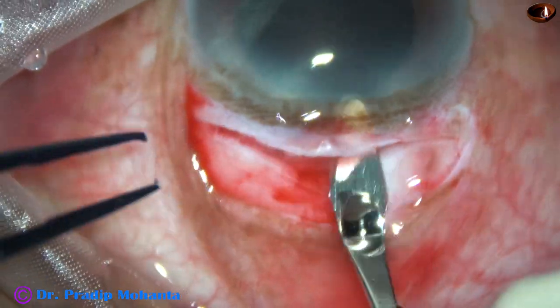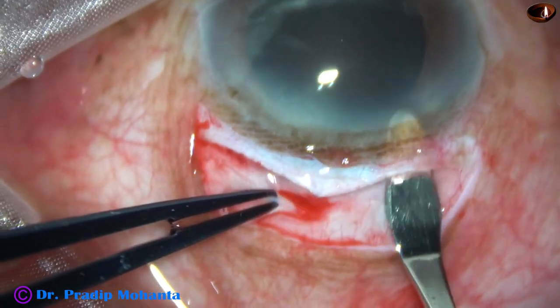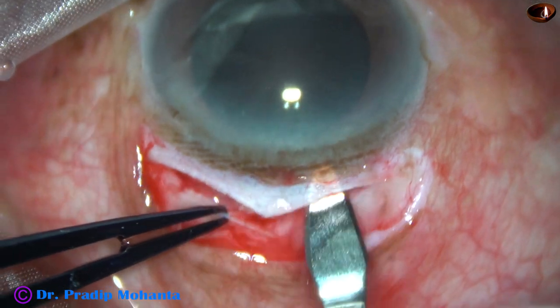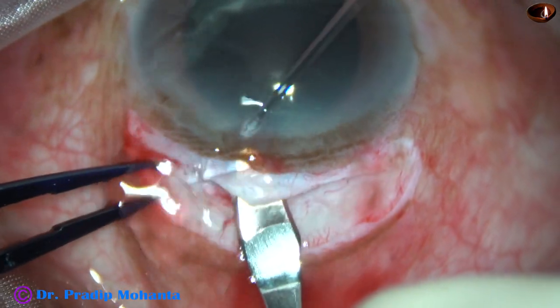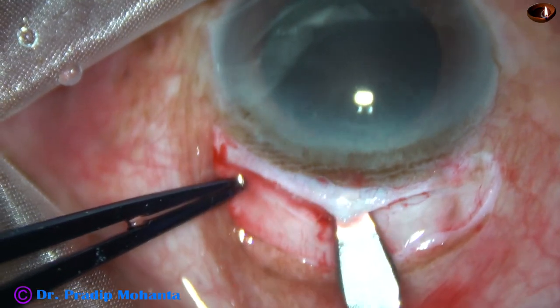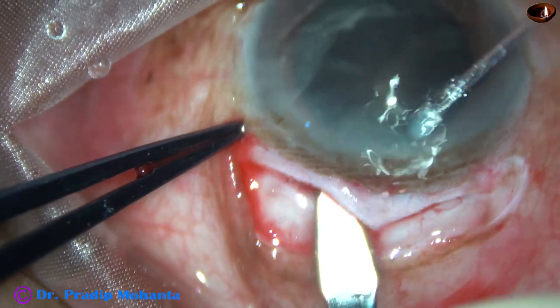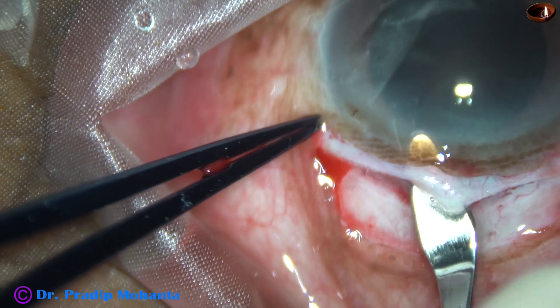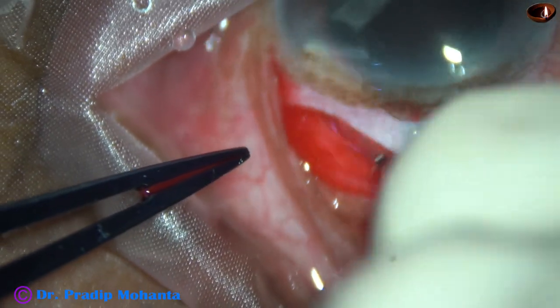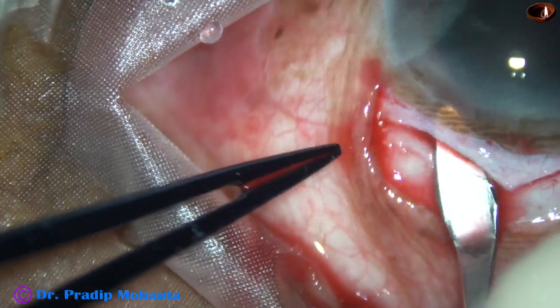Now here I go into clear cornea for about 1.5 millimeters, then sweep backward and to the right and complete the sclerocorneal tunnel on the SICS wound of the right side. In the same plane, I go to the left side and carry on the dissection.